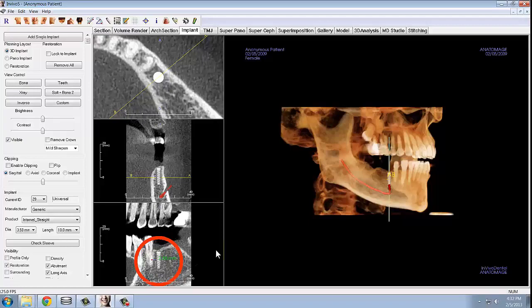Generally, you want to have at least 2 mm between implants and adjacent teeth, 3 mm between adjacent implants, 1.5 mm from the implant to the buccal ridge, and 0.5 mm from the implant to the palatal ridge. The reason why it is recommended to place the implant more towards the palatal side is because of the possibility of tattooing, or a graying of the soft tissue due to the implant, which can be unesthetic.